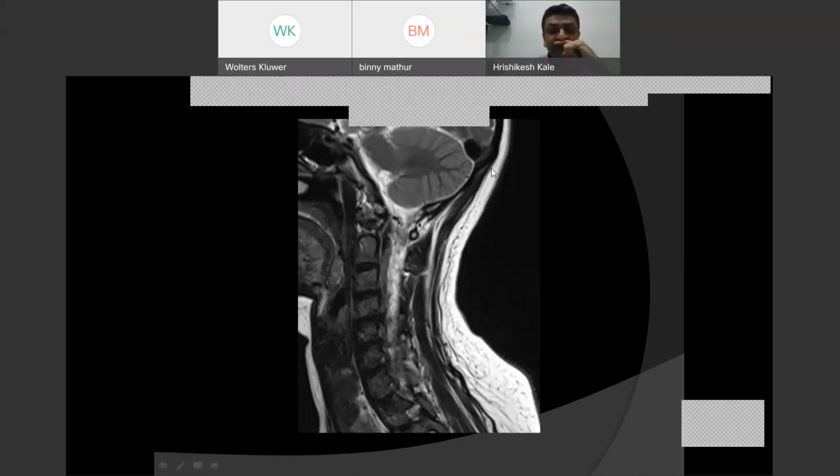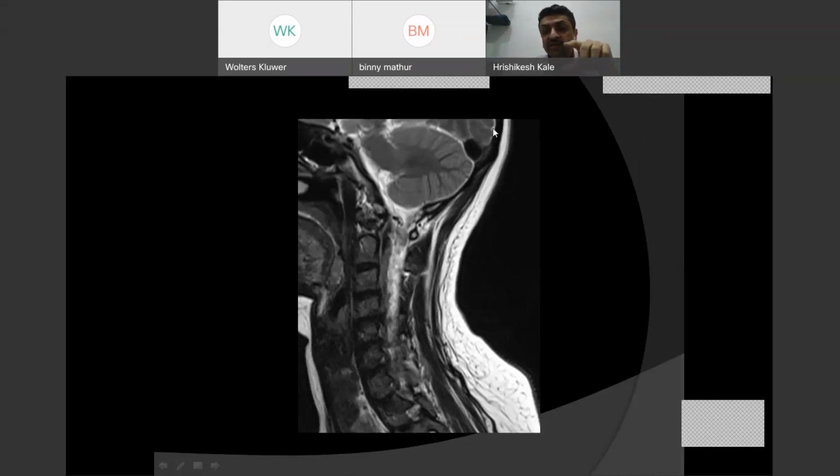One important finding which you may see is that typically dural venous sinuses have either flat or concave margins. In some patients, if you see this convex margin along the margin of your transverse sinus or your sagittal sinus, that can suggest presence of engorgement of the veins. So this may suggest presence of SIH. This is not a very specific sign, but this is something you can look for when you're trying to evaluate a patient for SIH. As I told you before, not all signs will be present in all patients. So it's important to try to get as much information as you can from your imaging.